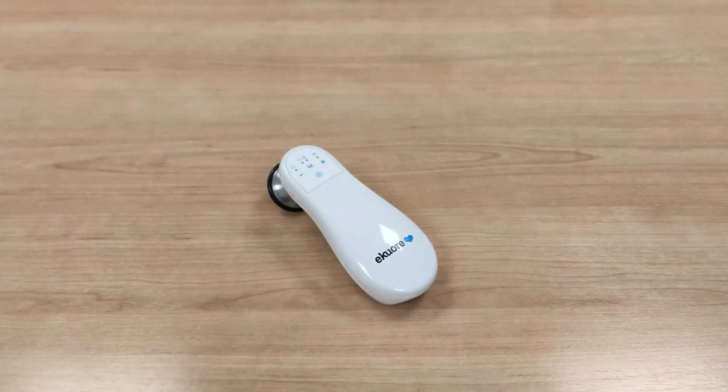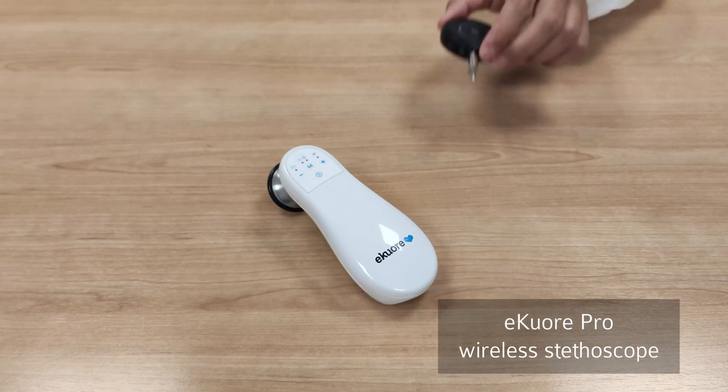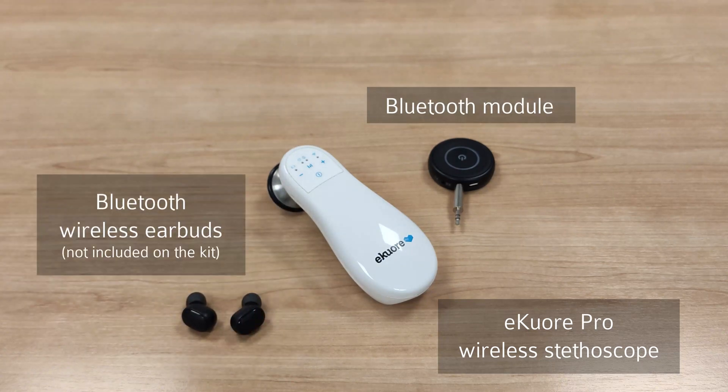Our solution to minimize the risk of infection is the E-Cure Pro wireless stethoscope, Bluetooth module, and wireless Bluetooth headphones.